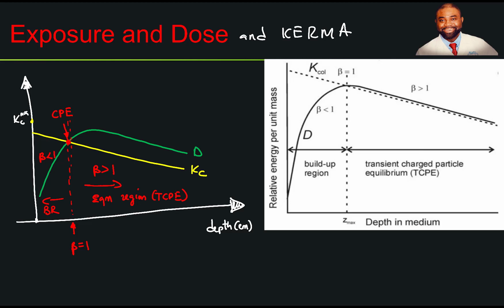When the radiation initially hits the medium, the electrons are forward peaked, so the electrons travel a given distance, equivalent to about their range, before depositing their dose.